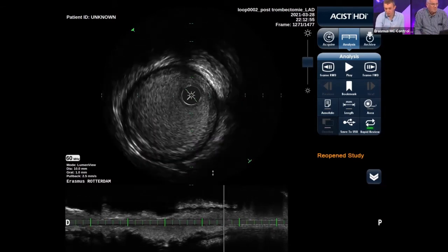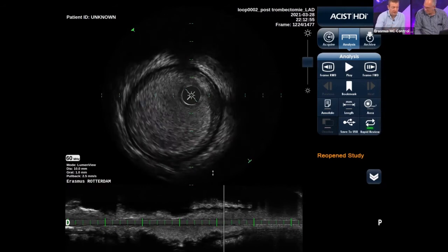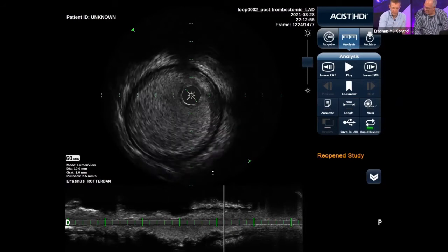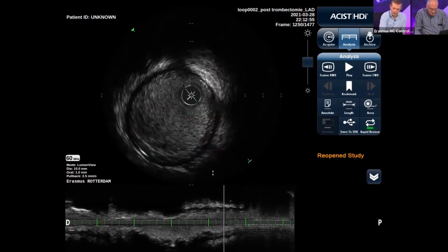Do I want to confirm the amount of thrombus? Only then can you make your procedure fast and easy with respect to the use of IVUS. So there is no point in doing IVUS and directly starting to measure. Just do whatever is intended based on the initial pullback.